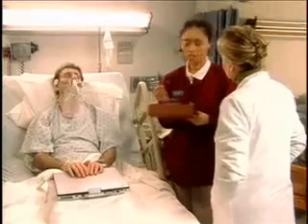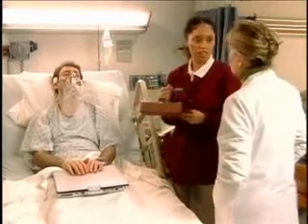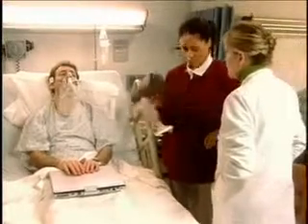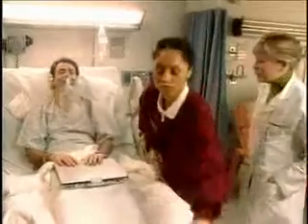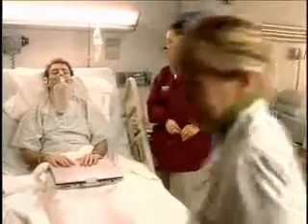Right, so I'll remove the face mask and dry the skin every 2 to 3 hours and check for any skin irritation. Good. And powder should never be used around the mask. Got it. Won't touch the powder. I'm going to stay with Mr. Simon, make sure he feels better, and recheck his oxygen level. Okay, Mr. Simon?